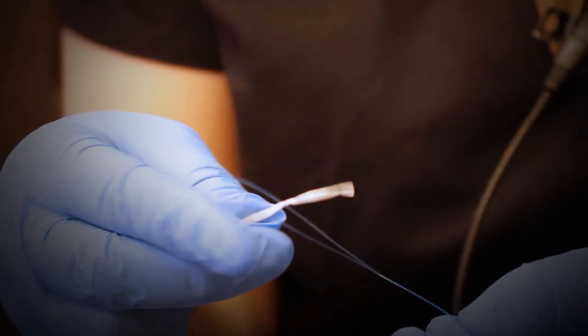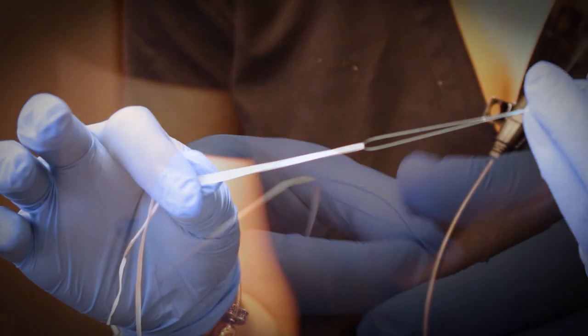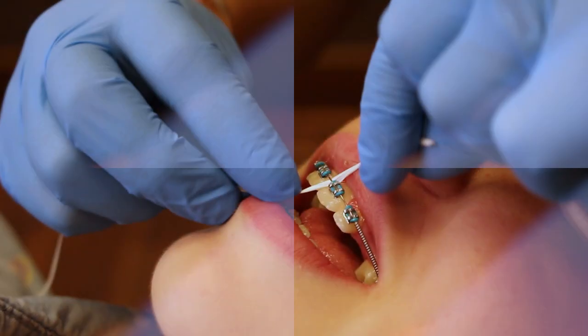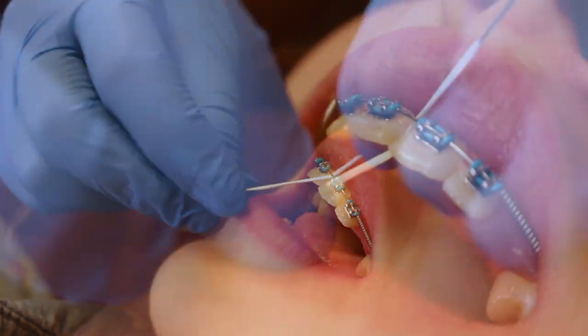And then to floss, you want to use the floss threader so it'll make it a lot easier. You thread the floss through the threader and then use the threader to go in between the brackets and underneath the wires. Pull it all the way through until the floss is between the brackets, and then floss like you normally would.